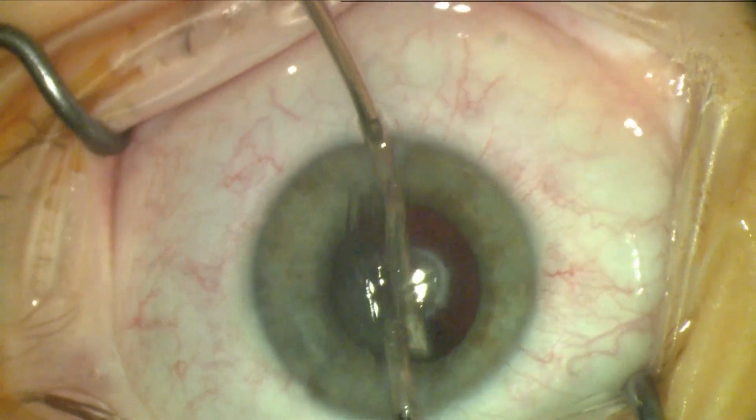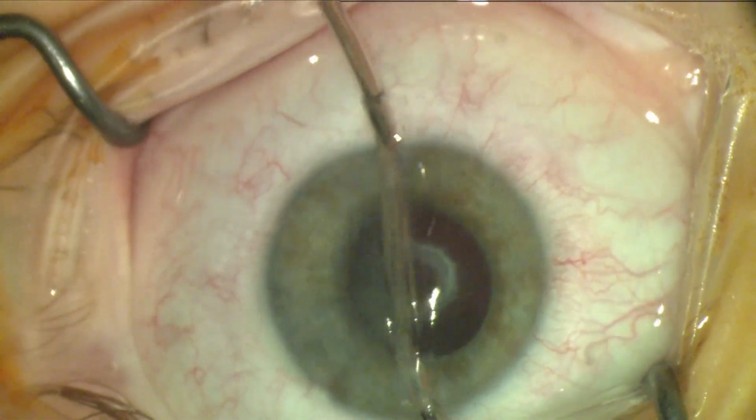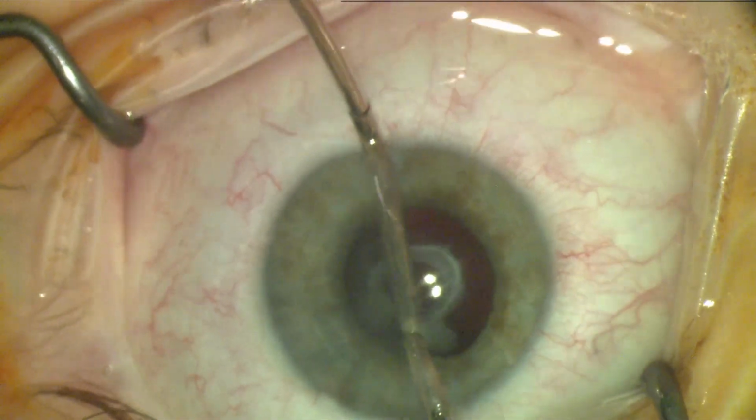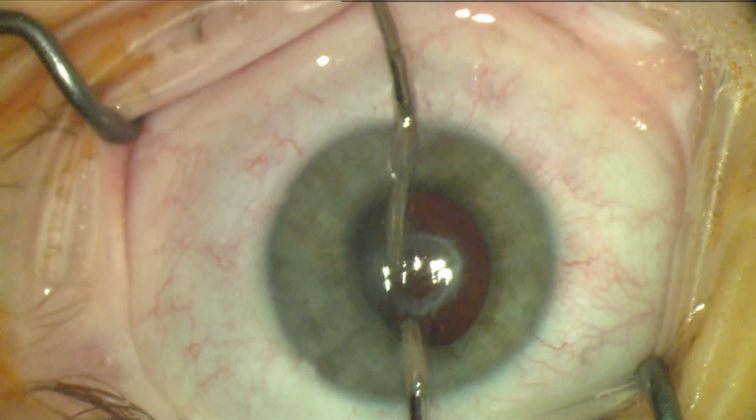When removing the Sommerings ring, try to stay within the capsule to avoid losing any material into the vitreous space. Many of these cases have an open posterior capsule due to a primary capsulotomy that had been done when they were babies.